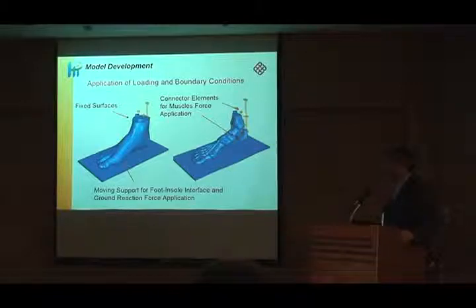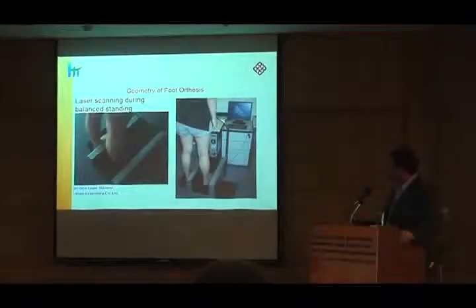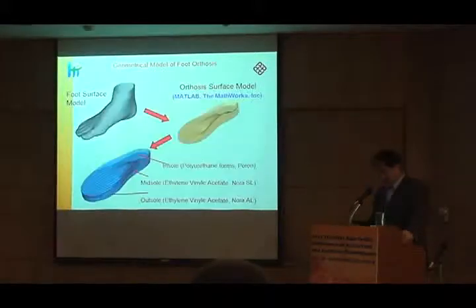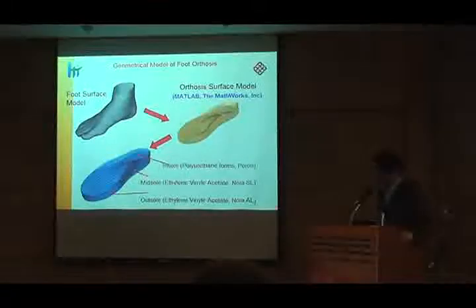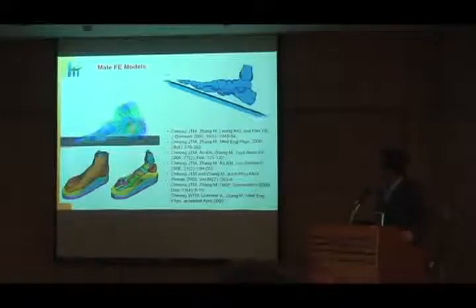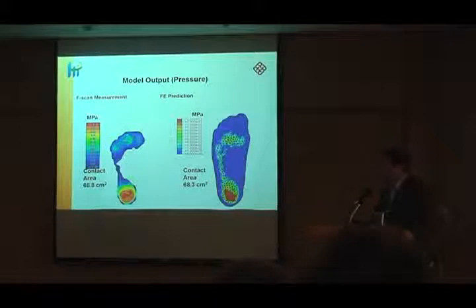For muscle, to stimulate the three major muscle groups. For the insole, we're using a scanner. This is much more expensive than what Professor Sun said. We're using the in-foot scanner to get the foot shape, then make the insole, then combine the insole with the foot model, so the model can give the prediction between foot and contact.